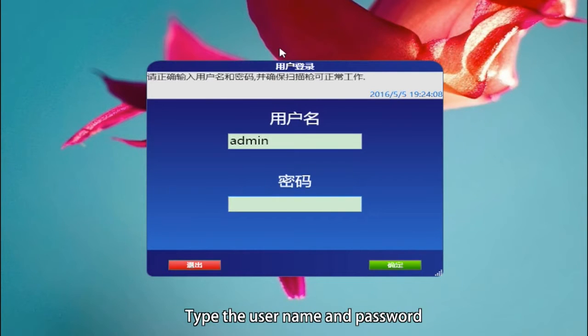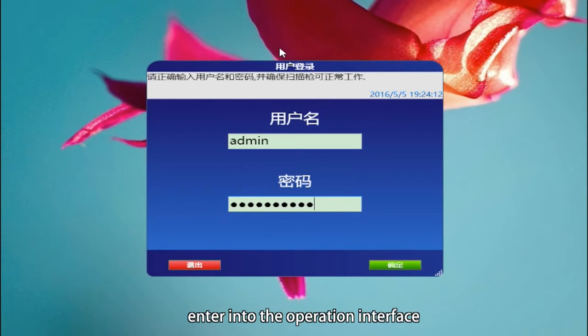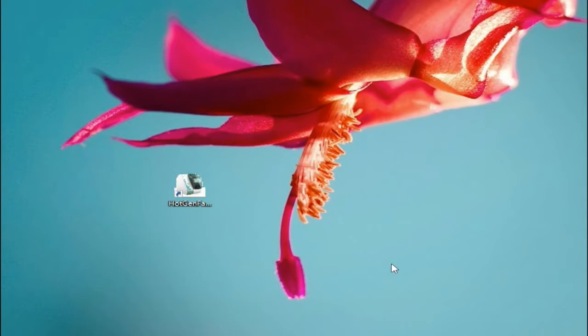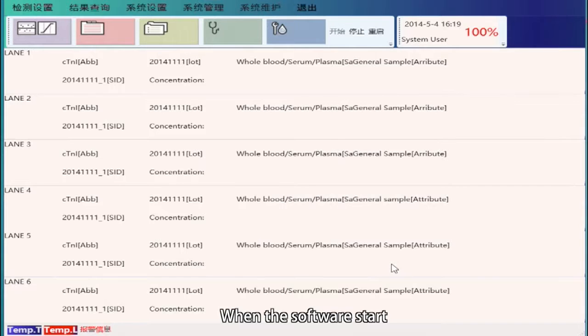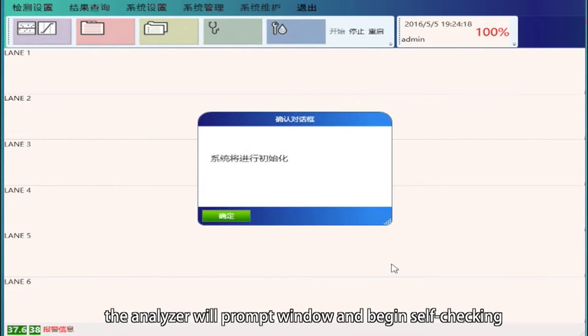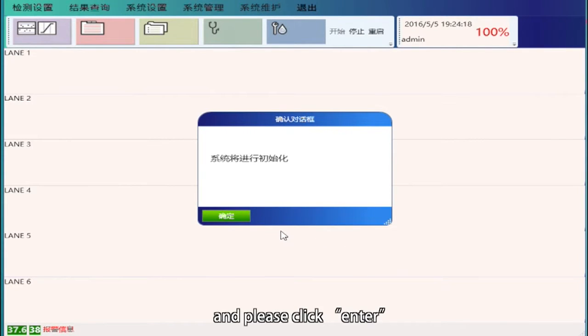Double-click to start the MQ60 operation software. Type the user name and password to enter the operation interface. When the software starts, the analyzer will prompt a window and begin self-checking. Please click Enter.